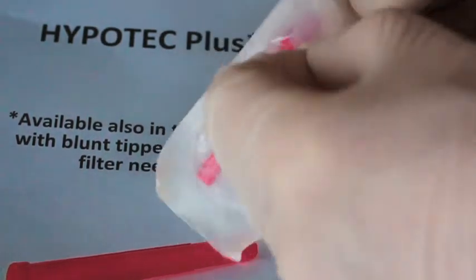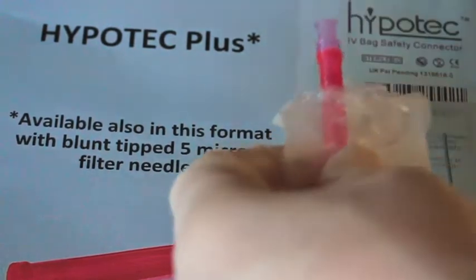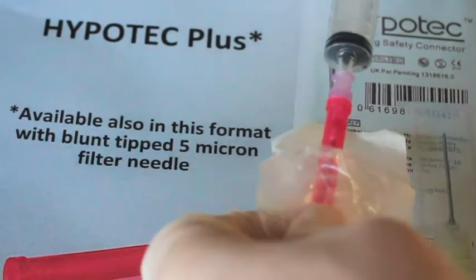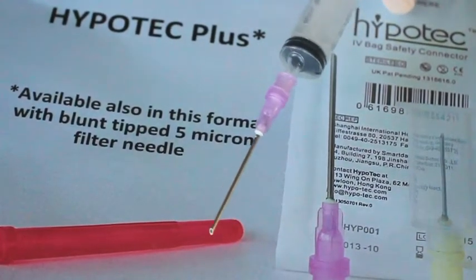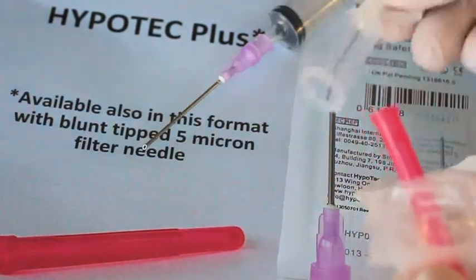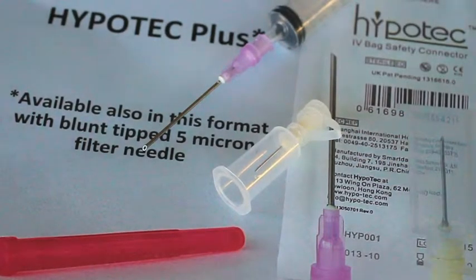By holding the needle guard through the open packaging, one can simply connect the syringe to the needle and remove it from the guard. When Hypotec itself is then required to inject into the IV bag, it can be aseptically removed by holding its protective luer cap.